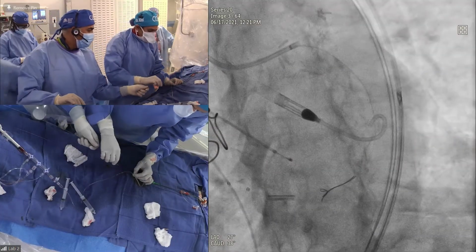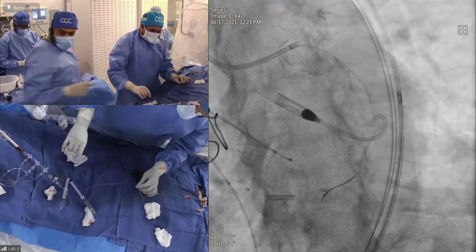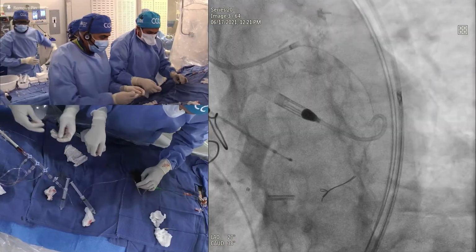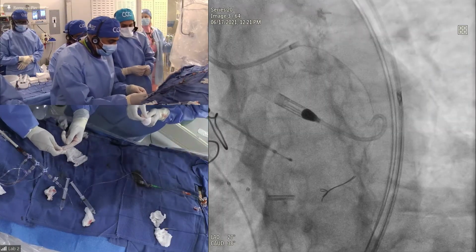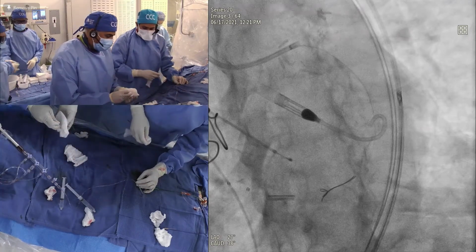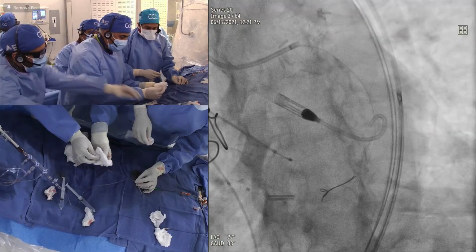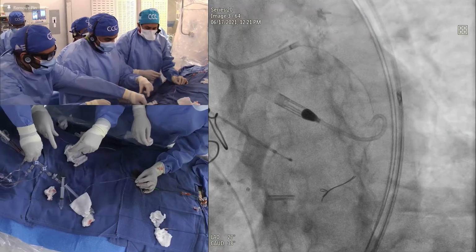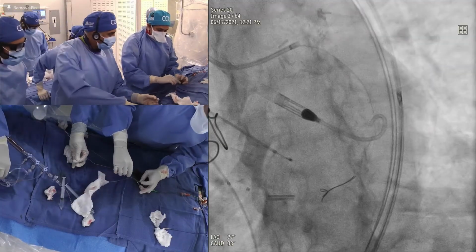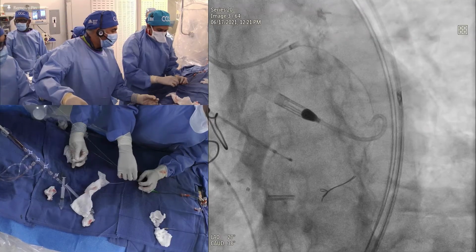Roxana, one important point, I think in this case, is why we did not go to a larger burr. I hope we made that very clear. We saw a 1.25 burr dissection, but then the other question was, when the balloon wasn't going, could you have come in with the rotor burr past the dissection and just do a little bit of distal ablation. But it looks like you were able to finally open it with the balloon, and now you're going to stent it and it should come out okay.